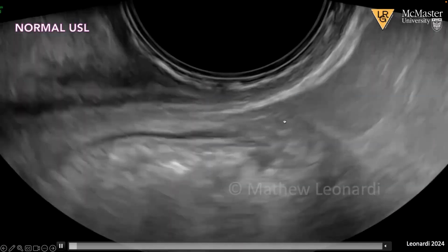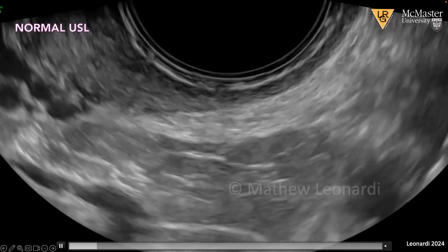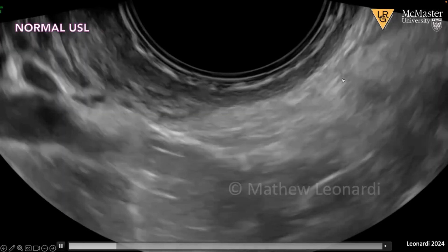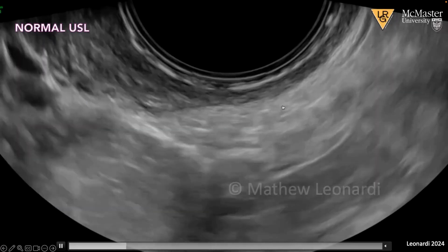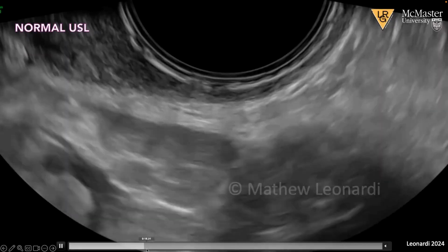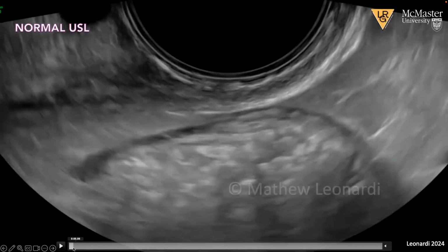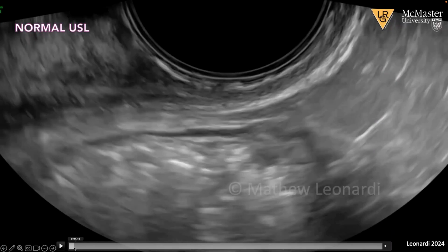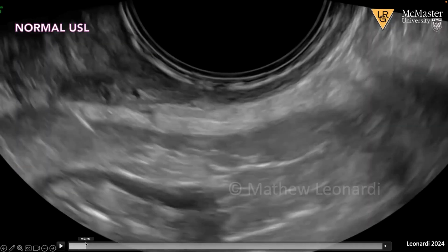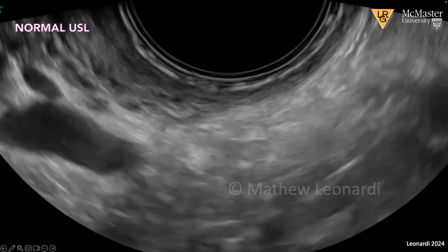And so when we are trying to find the uterosacral ligaments, we have to be in that posterior vaginal fornix, and we lateralize the probe to accentuate this white thick line from the center where that line is very thin. Now we'll go back to the beginning of this clip where we see the very thin white line in the center of the pelvis. This is the peritoneum overlying the pouch, overlying the vagina, and this is the uterosacral ligament here. So this is what a normal uterosacral ligament looks like.